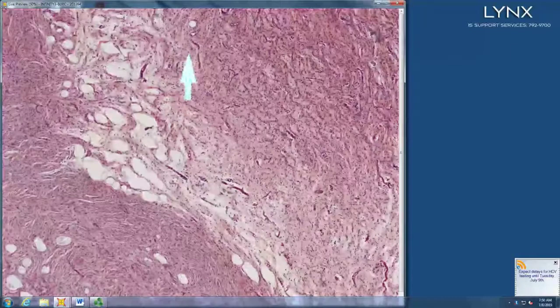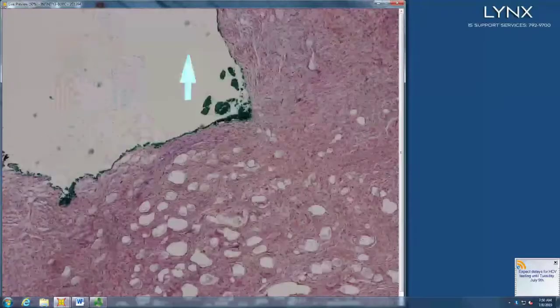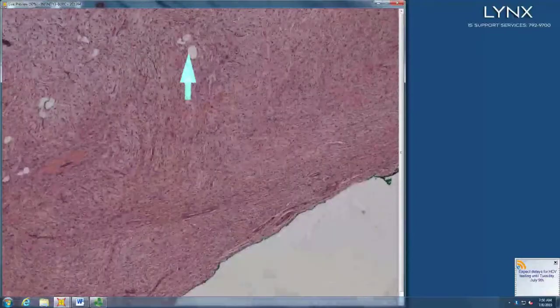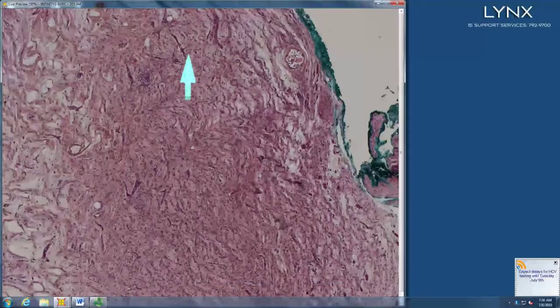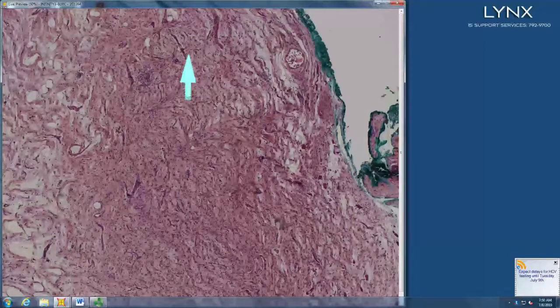Nerve sheath myxoma? No, those are nested. I can't think of the name for the DFSP version of a peripheral nerve sheath tumor. Not MPNST, but what grows like a DFSP but is a neurofibroma is diffuse neurofibroma, which is a disease-defining tumor for von Recklinghausen's.